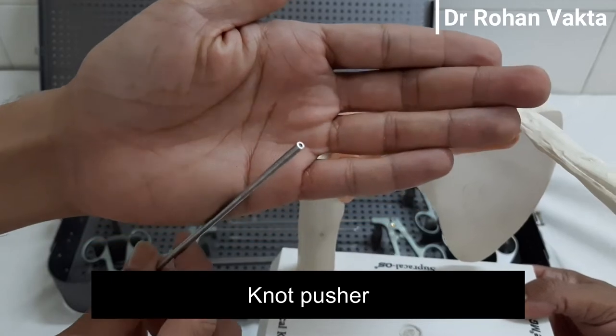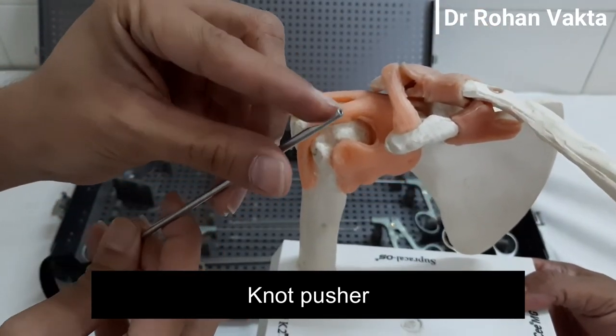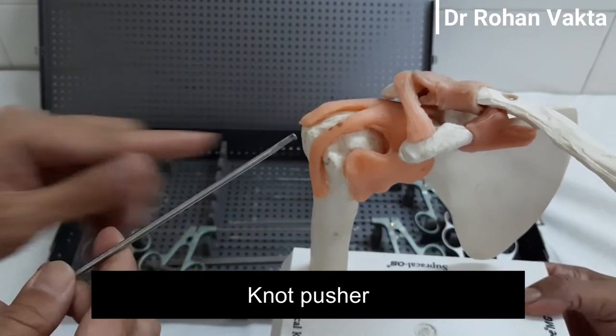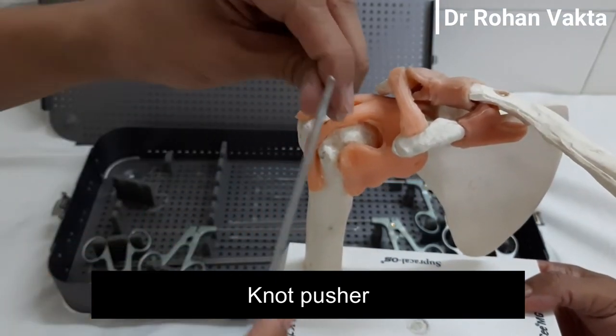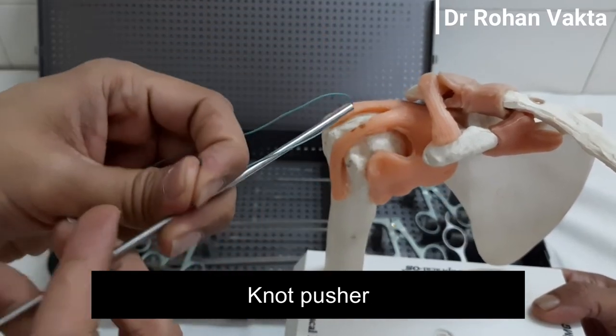This is the knot pusher. It is used to take a sliding knot and push the knot inside the joint. The ideal knot pusher should have a blunt tip. If the tip is very sharp, then while pushing the knot inside, it may cut the suture material.